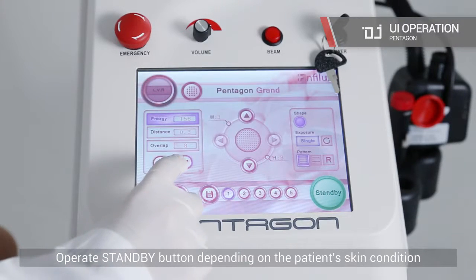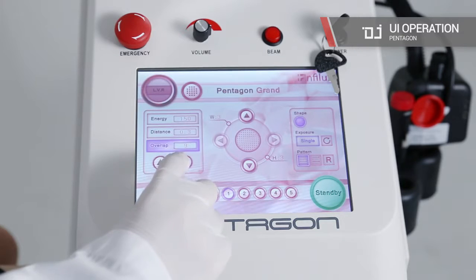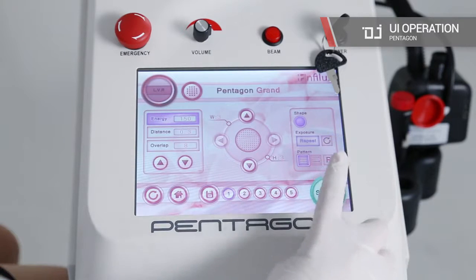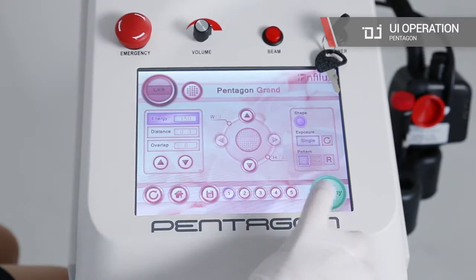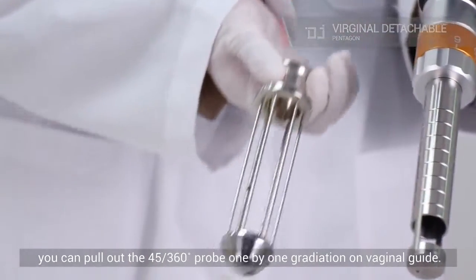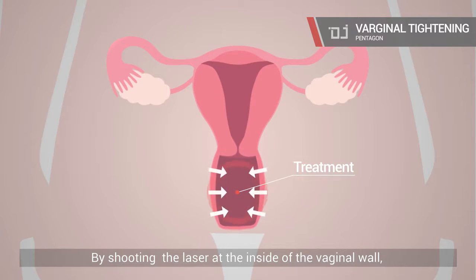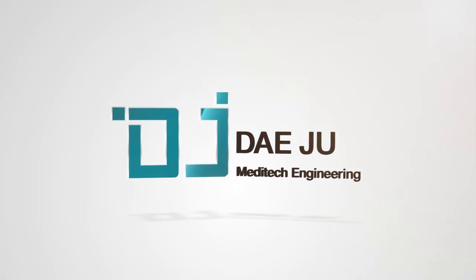Operate the standby button depending on the patient's skin condition after setting the value on the UI. When you perform a vaginal treatment, you can pull out the 45 to 360 degree probe one-by-one graduation on the vaginal guide. By shooting the laser at the inside of the vaginal wall, you can see the improvement effect of vaginal tightening. Keep on watching. Thank you.